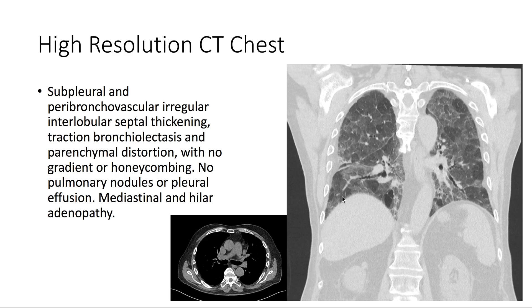Additionally, there's subpleural peribronchovascular interlobular septal thickening. There's traction bronchiectasis and parenchymal distortion. No gradient or honeycombing. No pulmonary nodules or pleural effusion. And there is mediastinal and hilar adenopathy.